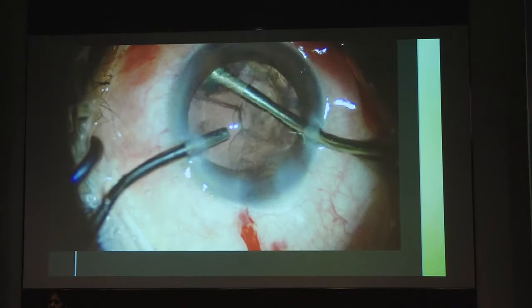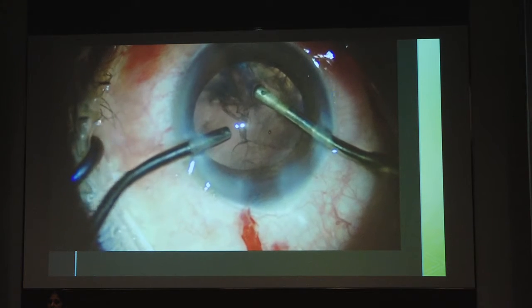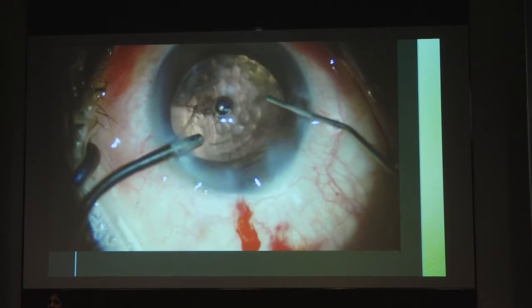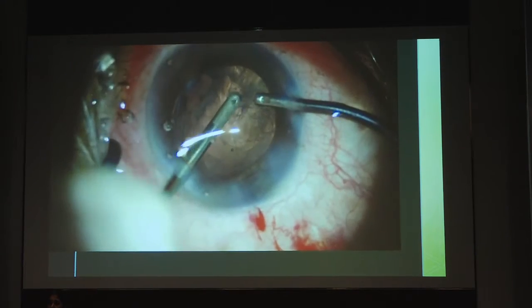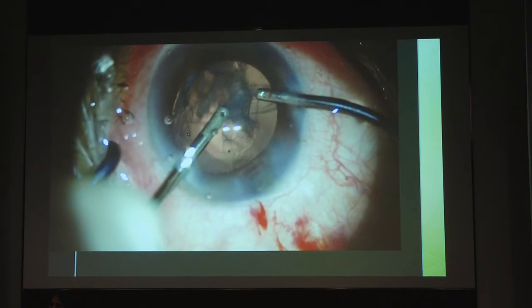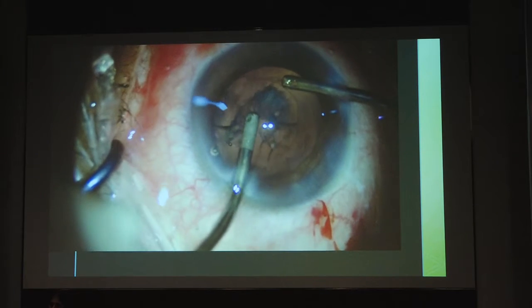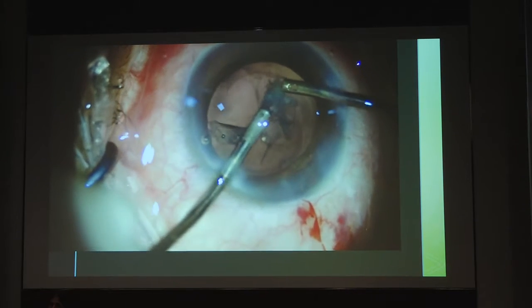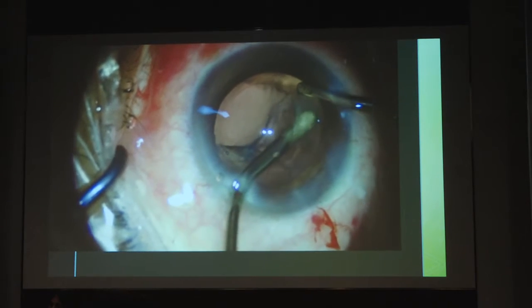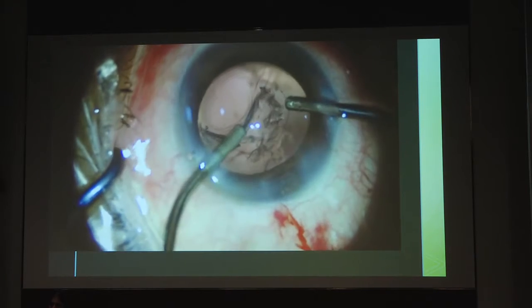And this is again an example of how a bimanual anterior chamber vitrectomy and aspiration is done. So there is a PCR somewhere here, and I'll show you as we start moving towards the case. See, this is the area of the PCR. Once we go near it, see the PCR is expanding in spite of the fact that we are doing a bimanual technique. So what do we do now?